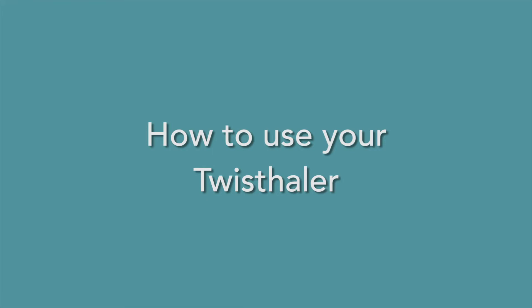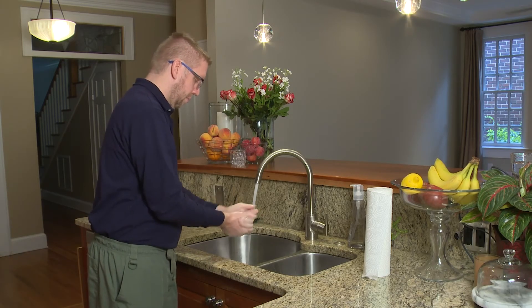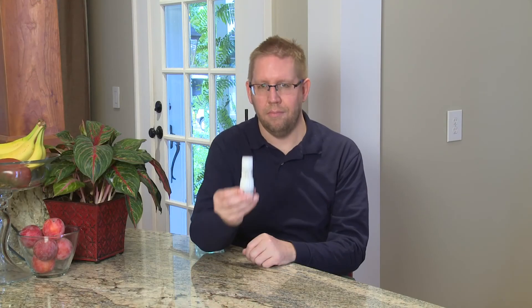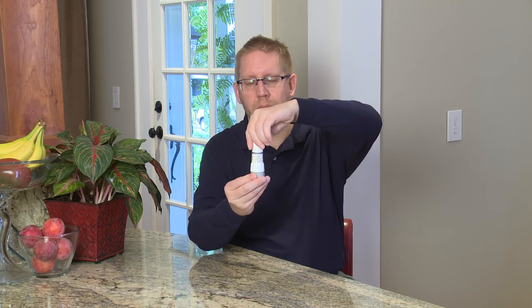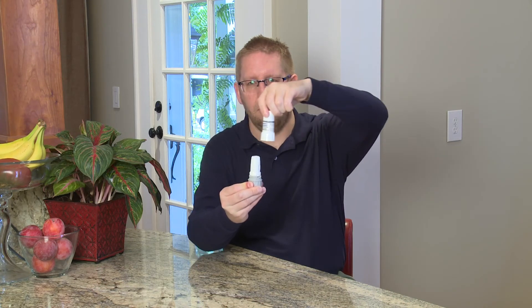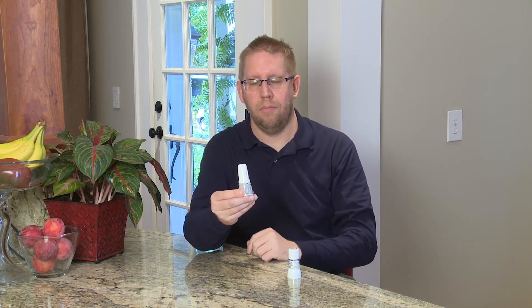It is important to wash your hands with warm soapy water and then dry them completely before using the twist haler. The first step to using your twist haler is to open it. Hold the twist haler up by the base and twist the cap counterclockwise to take the cap off. Once the cap is off, your medicine is ready to be taken.